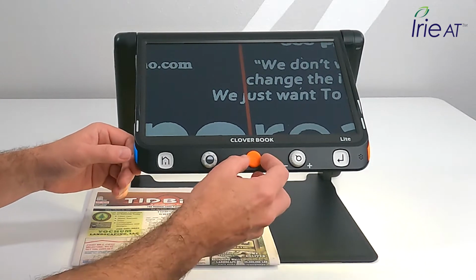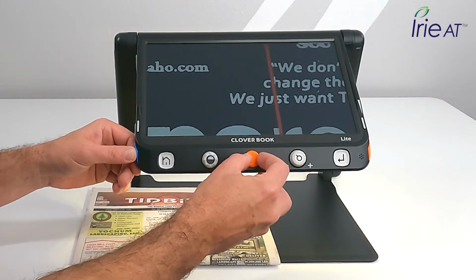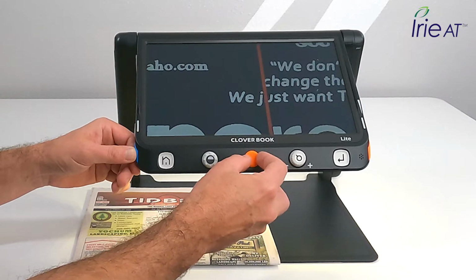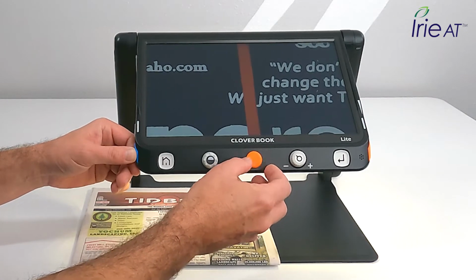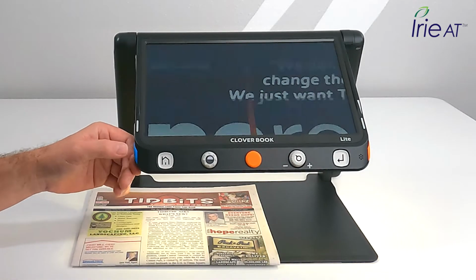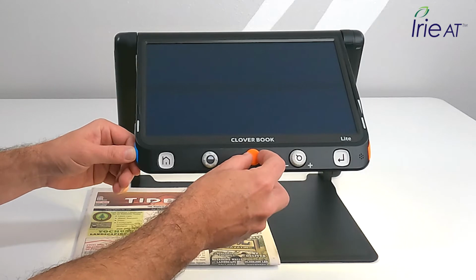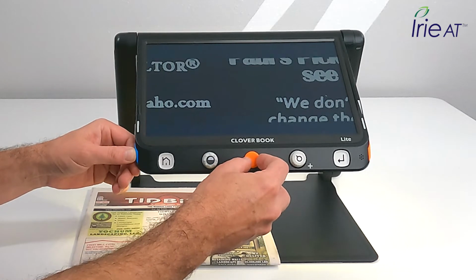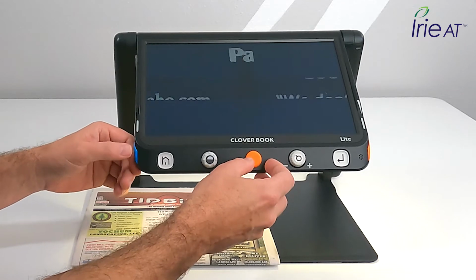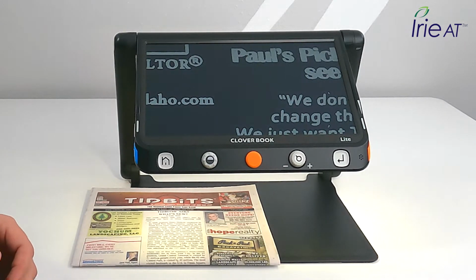Same thing with the vertical. I can move that guy around. Sorry, I have to press the button to do it, or I move my pan. I'm moving that left to right, and then I can also fatten or make that thin however I like it. Then we have blinds as well. You can make those big or small. You can move them around. A lot of real easy adjustments to line mask off, to only see what you want to see.